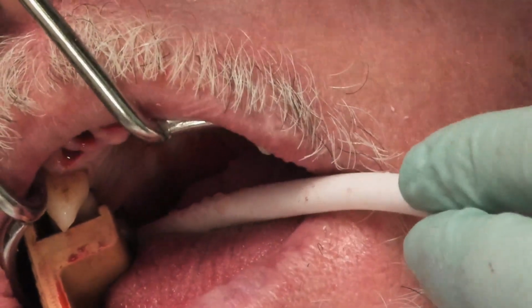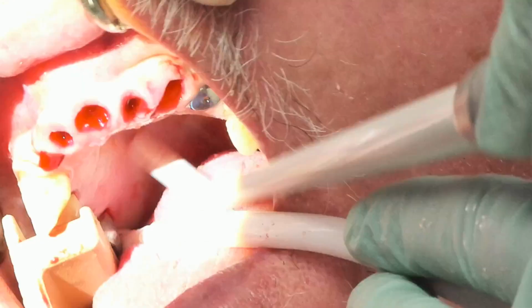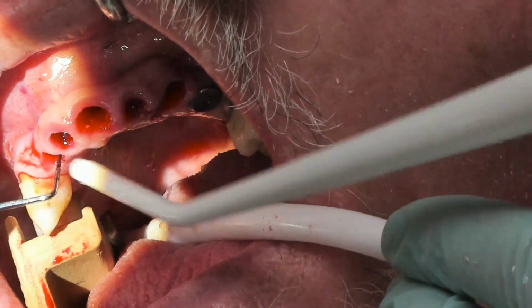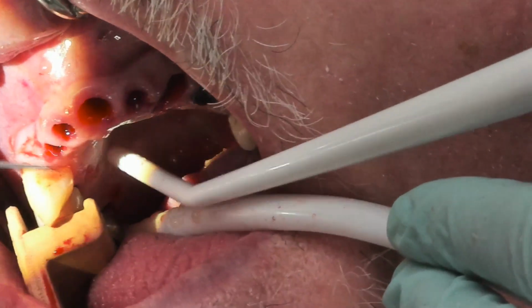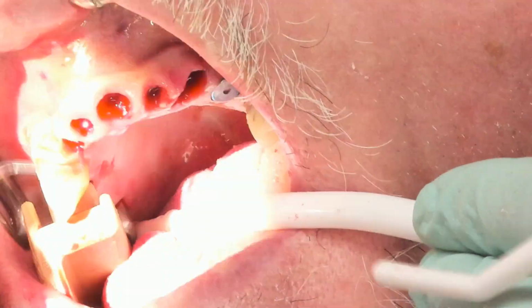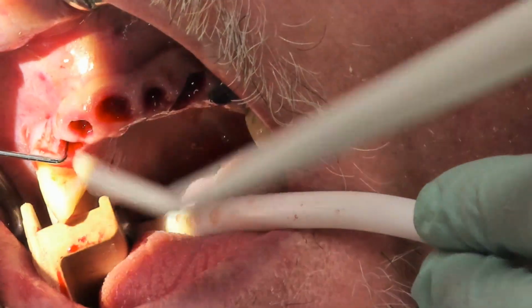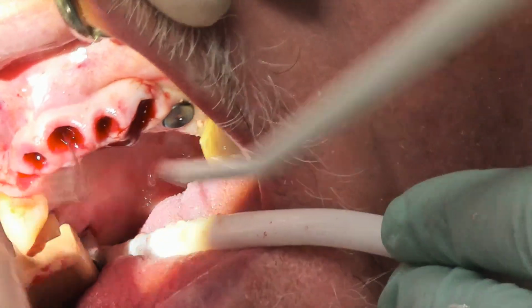Let me have an explorer. Actually, I'm sorry, protocol. Thank you. I'm just seeing the integrity of this buccal palatal shelf. See, look at our site here. Yeah, so I'm within the buccal plate. Still got my buccal plate, which will be good for the soft tissue. But because of this, with titanium, I would do a connective tissue graft here, which I'm not going to do with the zirconia implant.